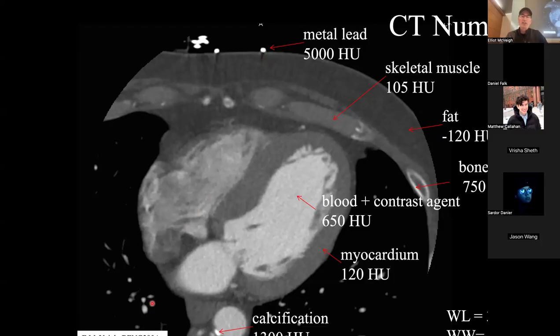Oh, down here? That's a great question. The question is, what are these bright spots? Does this person have leads in their lung? That is vessels in the lung. So your lung is just filled with both arteries and veins, right? Or coming back to the heart. And so when the contrast is in those small vessels, they light up.